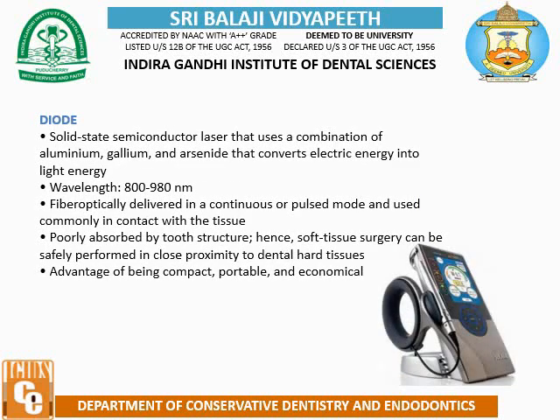Diode, a solid state semiconductor laser that uses a combination of aluminum, gallium and arsenide that converts electrical energy into light energy. Wavelength 800 to 980 nanometer. Fiber optically delivered in a continuous or pulsed mode and is used commonly in contact with tissues. Poorly absorbed by tissue structures like tooth structure. Hence, soft tissue surgery can be safely performed in close proximity to dental hard tissues. Advantages of being compact, portable, and economical.